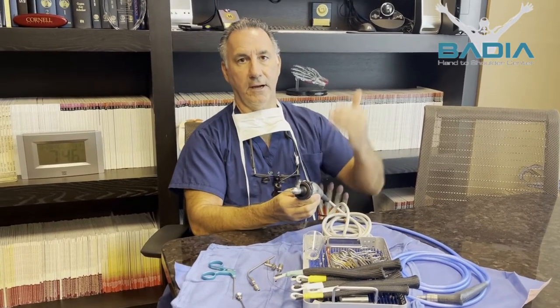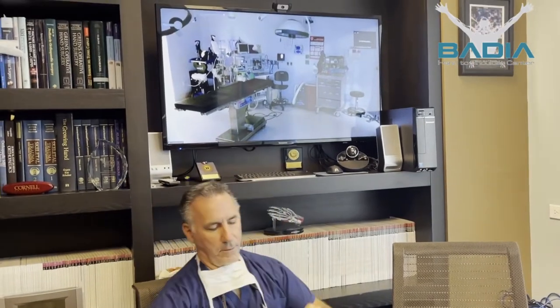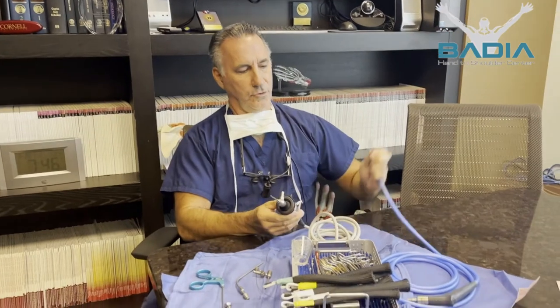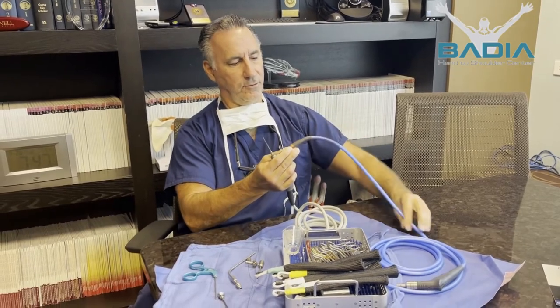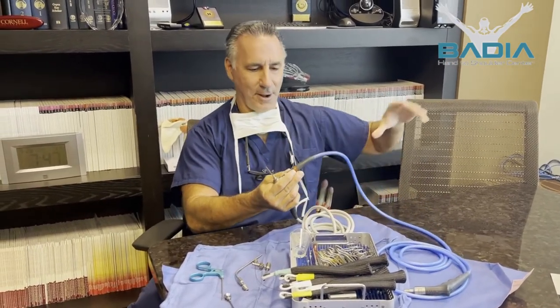So this is a fiber optic instrument with a camera, and this is then projected on a monitor. There's our operating room and our monitor looks much like this. This allows me to illuminate the joint with the light source — this is connected, this lights up. It looks pretty cool, looks like a disco in the operating room.